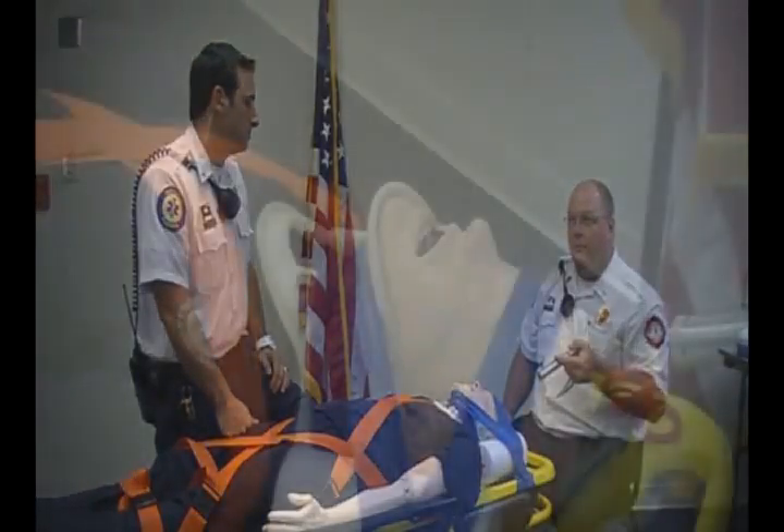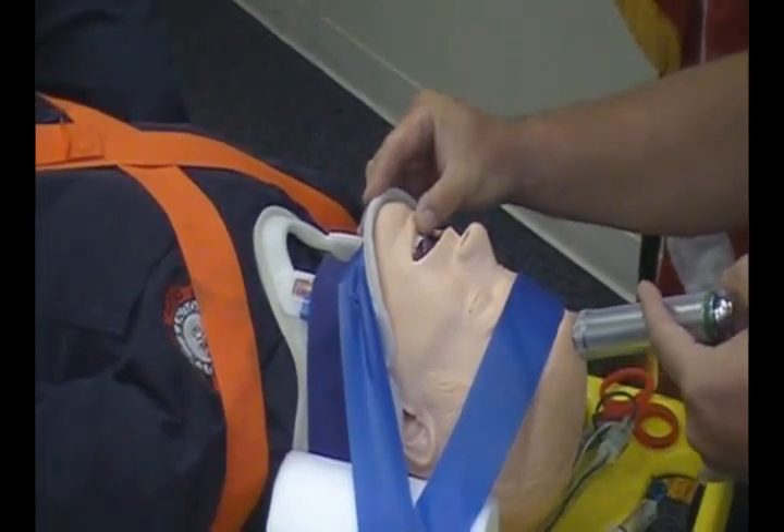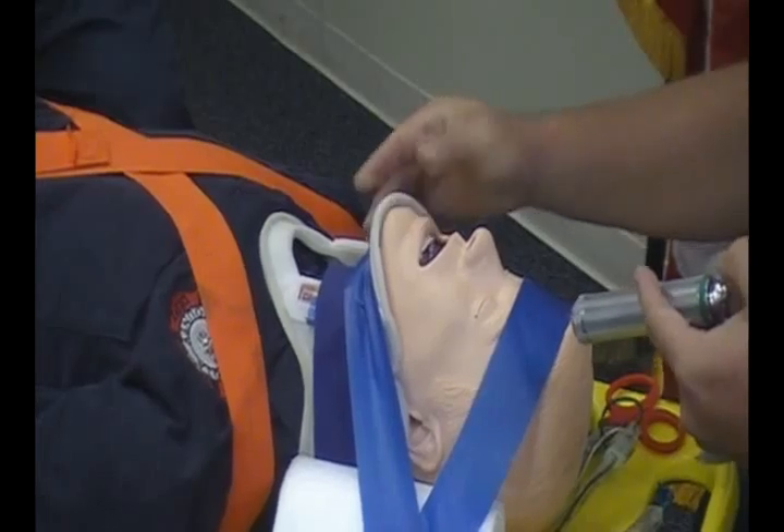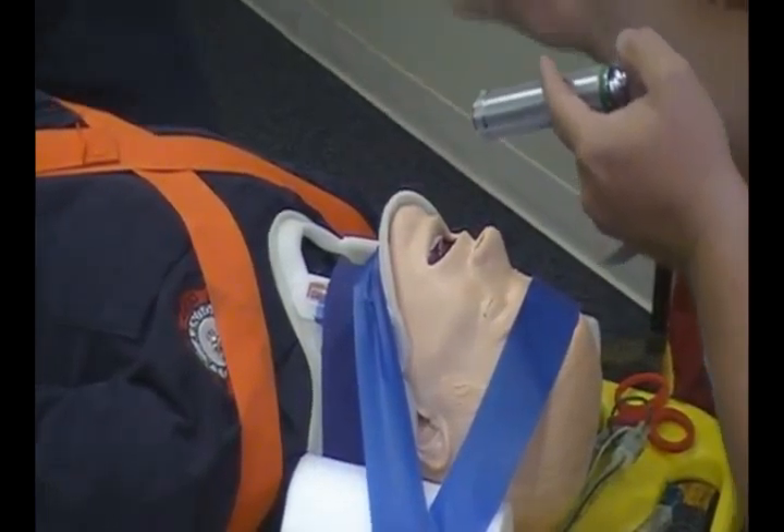When a patient is fully immobilized, a common problem is the inability to open the mouth and get good visualization. Remember, this is due to the bottom chin strap impeding that, because it's meant not to move.